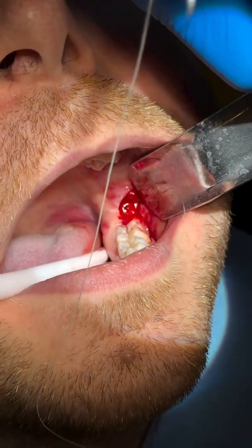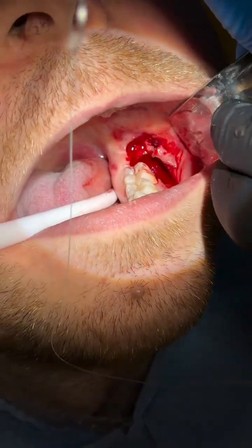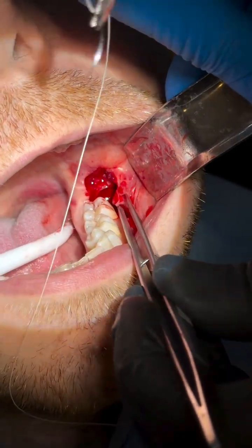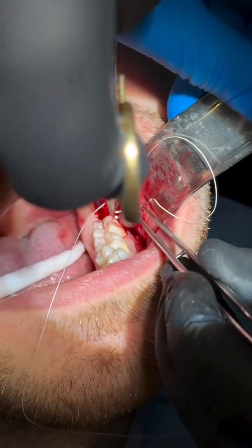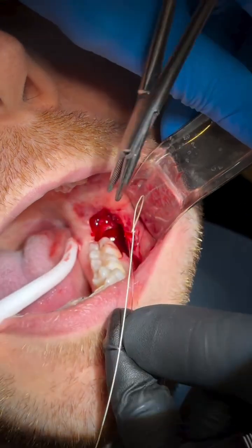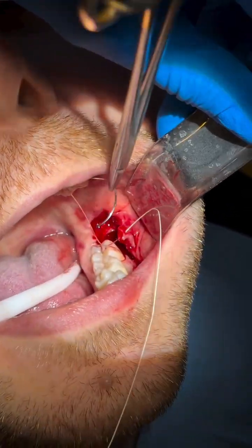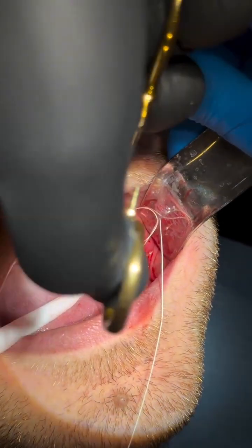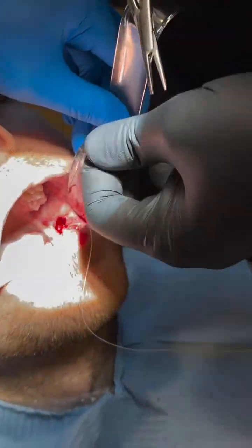Here I'm closing using 3-0 Vicryl and a reverse cutting needle. I always close distal to the 7, interrupted suture, surgical knot. You go through the buccal and then you thread it through the lingual, and you pick it up, and this is how I tie it off.